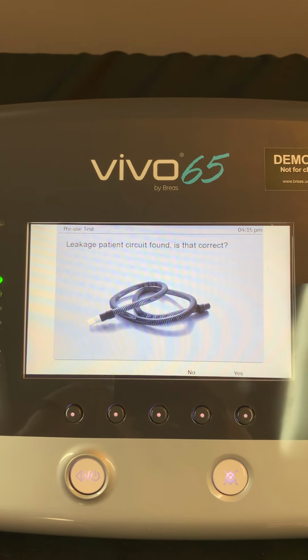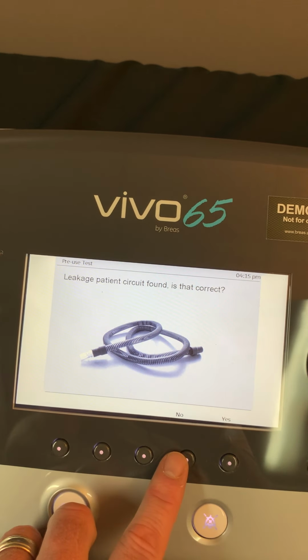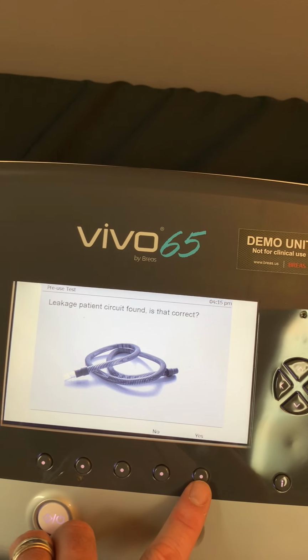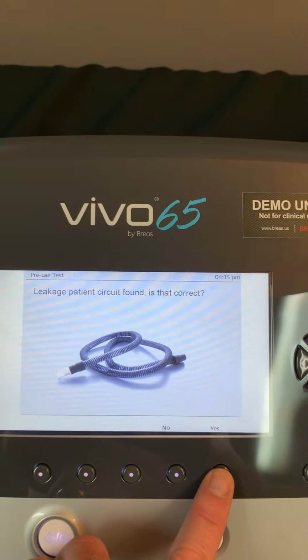The ventilator recognizes that there is a leakage patient circuit found. Is that correct? If it's not, you'll go ahead and click no. But we do have a leakage circuit attached to the machine. Okay, we have the basic passive circuit, and I'm going to go ahead and click yes.